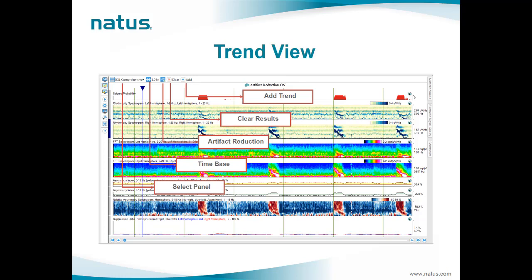One of the most important benefits is that no user intervention is required for running a new trend analysis. Users just need to choose and select the trend, and the system automatically loads the default parameters and configuration and returns the results. Even in the trend view, users can enable the artifact reduction feature, with much of the artifact removed, so calculations are almost entirely representative of cerebral activity, making trending an even more reliable tool.